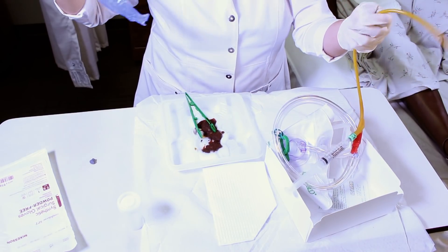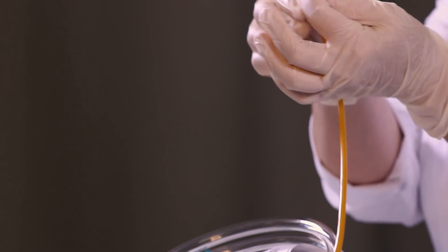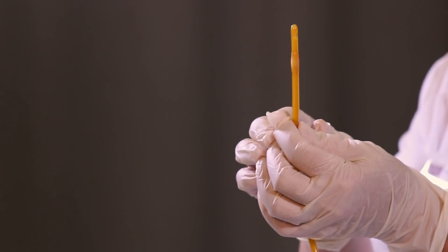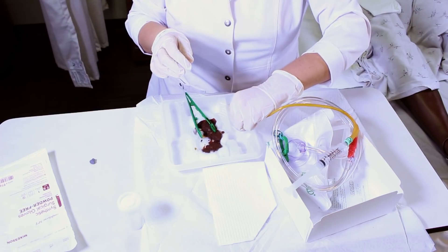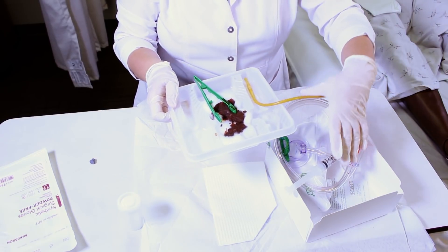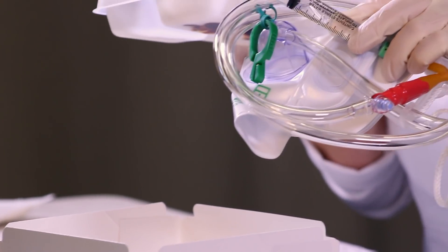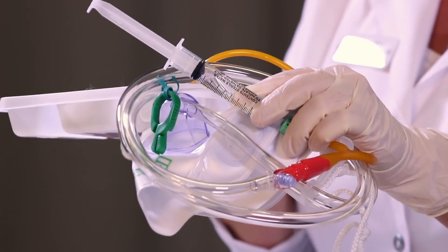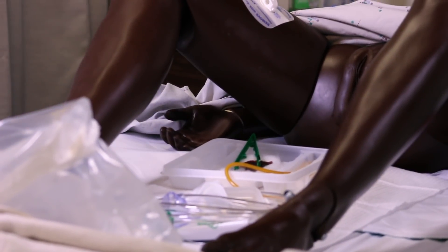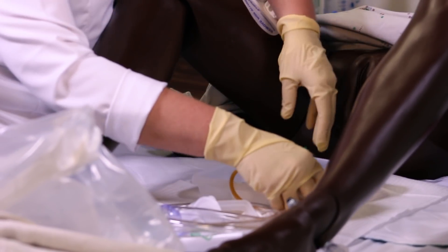I'm going to take the wrapper off the catheter and throw that in the garbage. In a female, you want to lubricate one to two inches — typically I do two. In a male, it's five to six inches of the catheter. Put the end of the catheter in the lubricant, keeping in mind I'm still sterile. Now I'm ready to move my catheter and the prep kit over to our sterile field set up on the patient's bed, making sure it's set up within an inch so the catheter is not out of the sterile field.